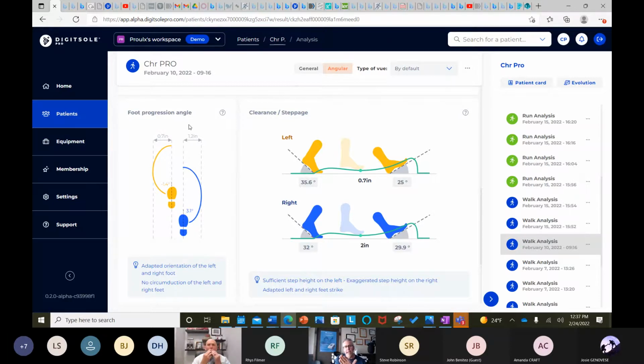Is there some external rotation, which there normally is when someone stands or walks, but then there's also a relative amount of circumduction based on the construction of the anatomical features of the iliofemoral joint, right? And so we get both of those values. We look at that toe out effect, the angle of external rotation, as well as the amount of circumduction. And as you might have guessed, there are some normative values for those too.